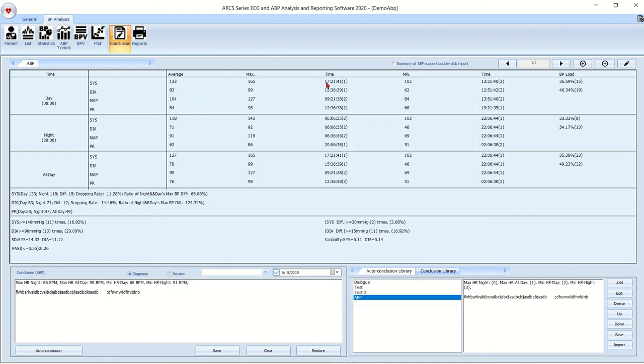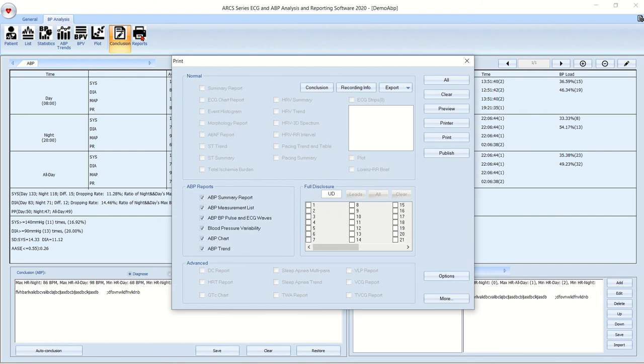At this point, that concludes both the conclusion and the report section of this ARCS 2020 Ambulatory Blood Pressure Monitor video education session.